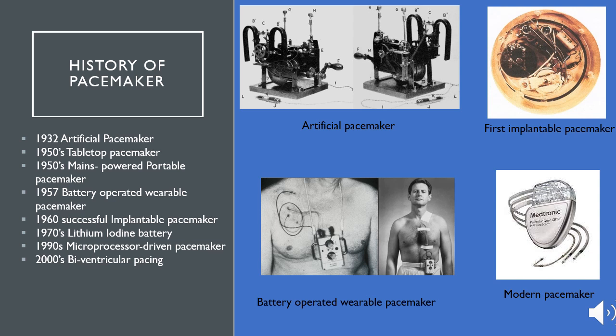In the 1950s, the Electrodyne PM65 pacemaker, an external tabletop pacemaker successfully designed to treat heart block, was developed. It delivered periodic electrical impulses and volts to a pair of metal electrodes strapped to the patient's chest directly over the heart. Unfortunately, the electrodes irritated the patient's skin, and the patients found repeated electric shocks painful.